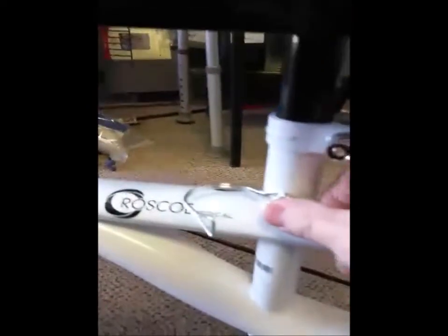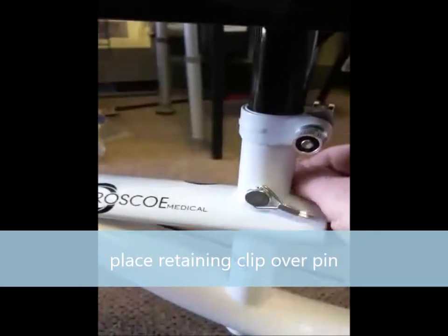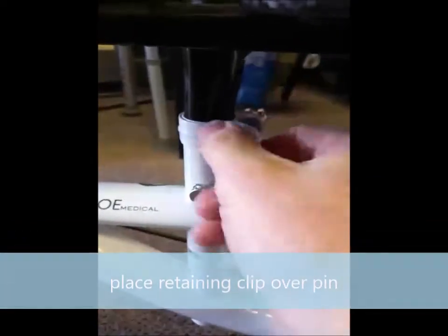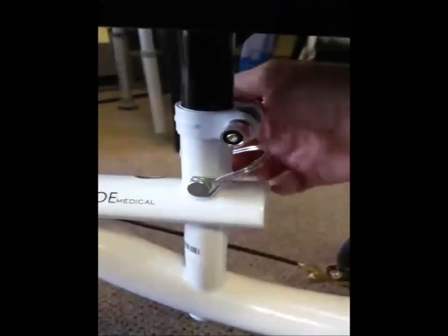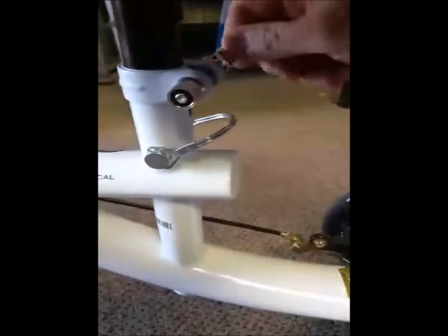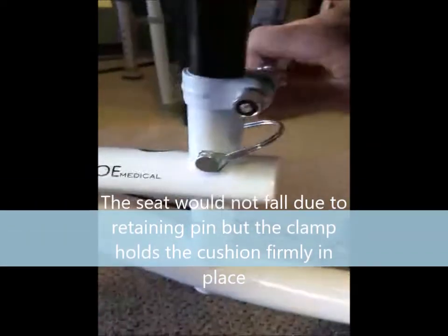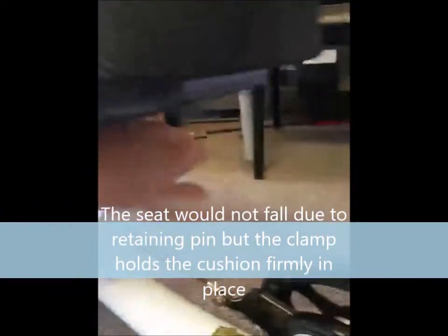To lock the pin, you put the pin in place and slide this retainer to hold the pin in. Then, like on a bicycle, you turn this knob to get it tight and cinch it down with the little lever.